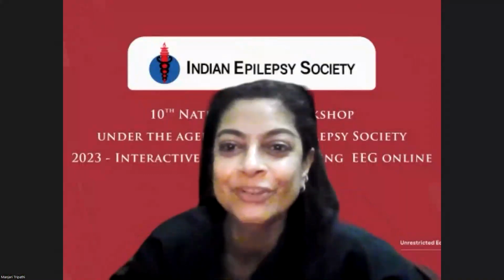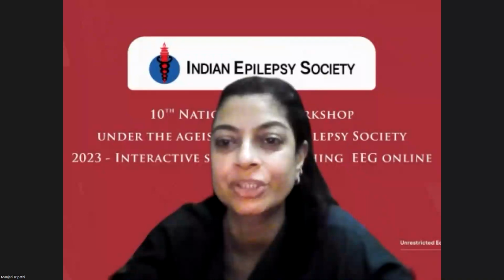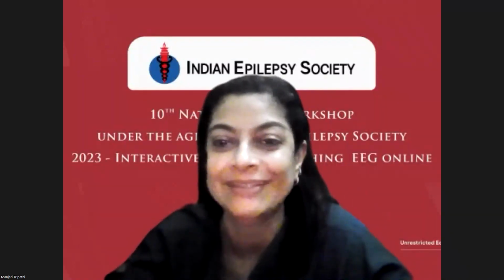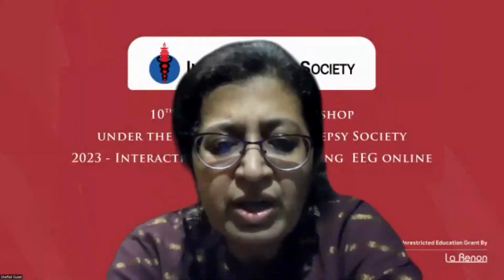Yeah, so the first question, Dr. Shefali, is how do you differentiate between suppression and attenuation? And this is asked by Dr. Russell.